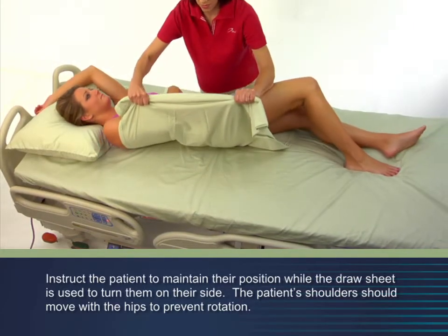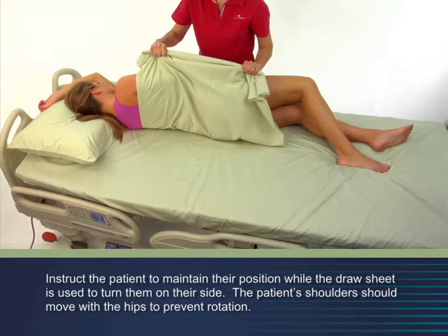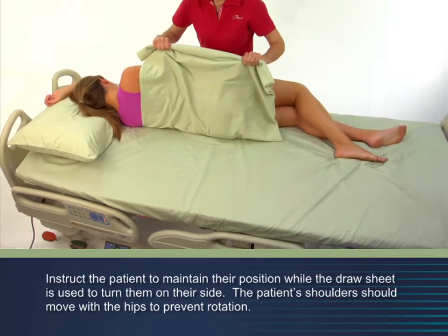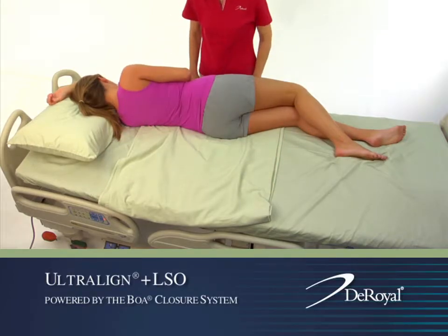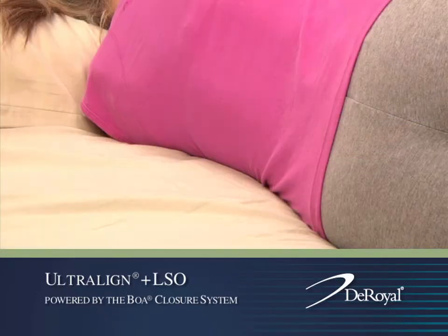To turn the patient onto their side, reach across the patient and grasp the draw sheet. On the count of three, pull the draw sheet toward you, rotating the patient to their side. Pull the draw sheet slowly, monitoring the patient for comfort and preventing any rotation of the spine.